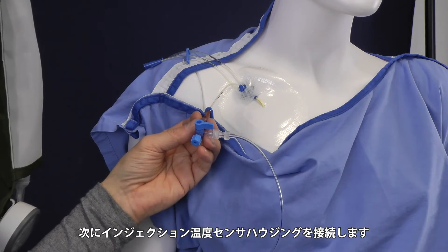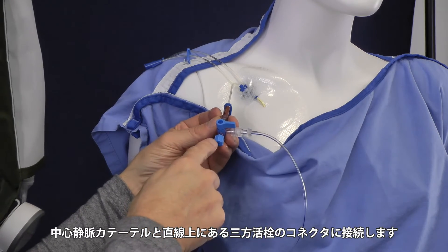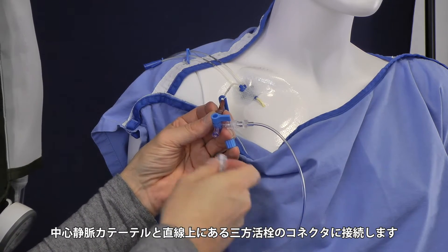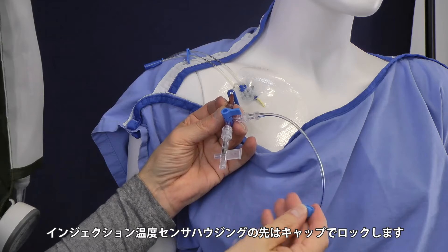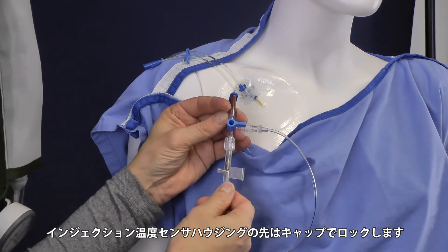The next thing you need is a temperature injectate sensor housing. Just place it simply on this part. Take off the blue cap here and place the temperature sensor housing and connect it clockwise, gently. Place your blue cap at the end of the temperature sensor housing, like this.